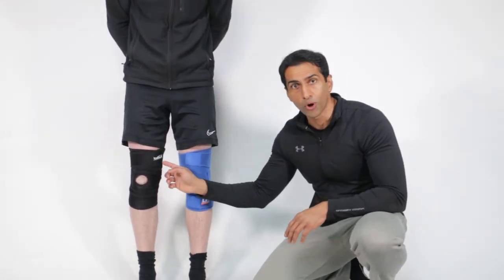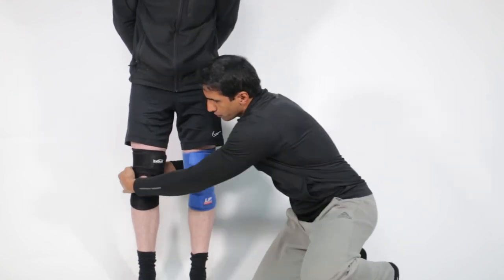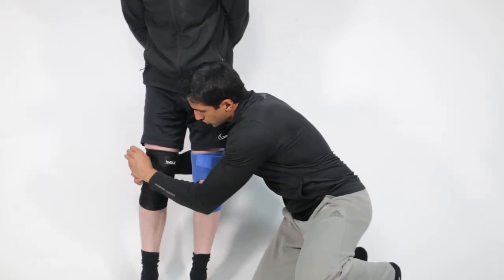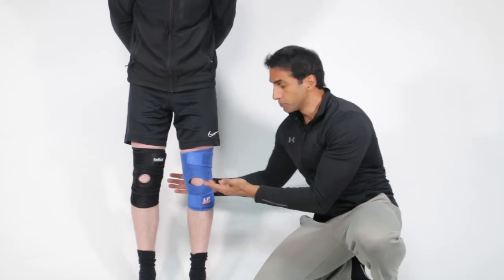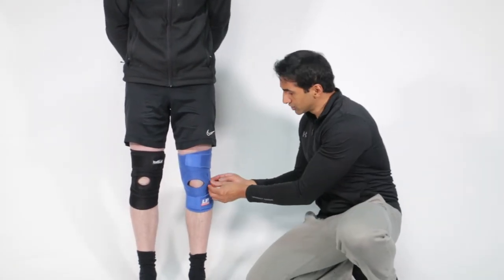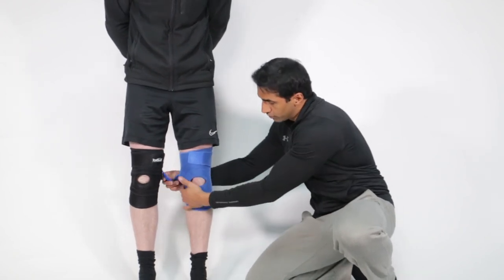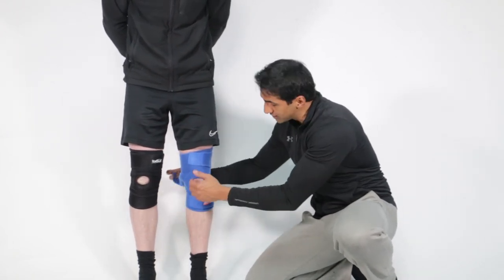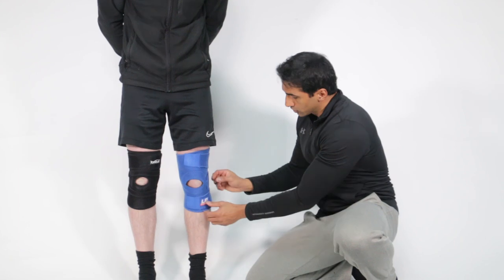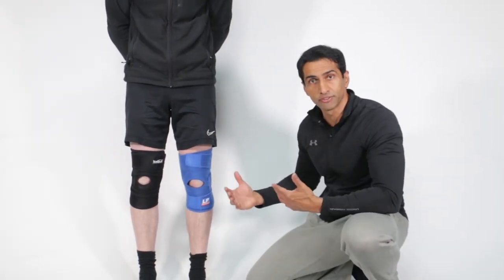Because it's got four anchor points — just going to demonstrate — you can actually adjust this in four different places, so you can fully customize the support. With the three-strap system, each strap is dependent on the other one. If you took one away it really loses a lot of its support, because it needs all of them wrapping around together. So you can't really adjust it as much, and you're at the mercy of how it fits to get any real support.